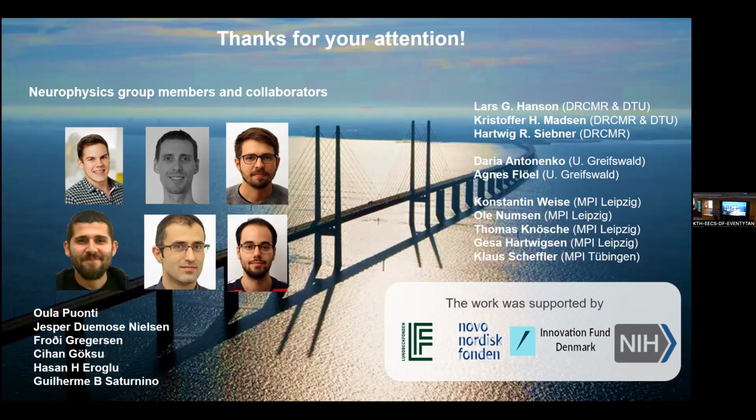The larger challenge is then that TMS also has auditory side effects and somatosensory side effects. You hear the click and you feel it. So even though you have a clean response to record, you still record a mixture of different sources. What you're really interested in is how TMS acts on the network where you stimulate a node, and then it spreads within the network, and that's what you want to track. But because it's overlaid by a lot of auditory and somatosensory co-activations, that's really a tricky thing to do.